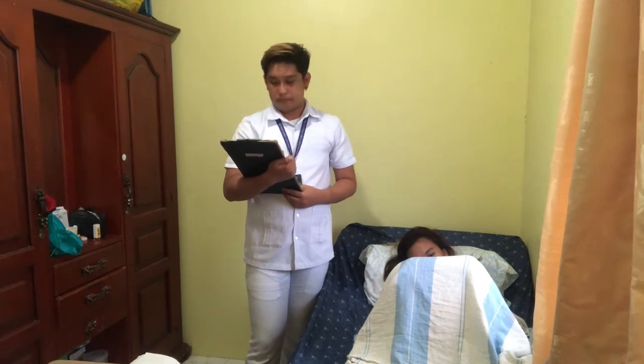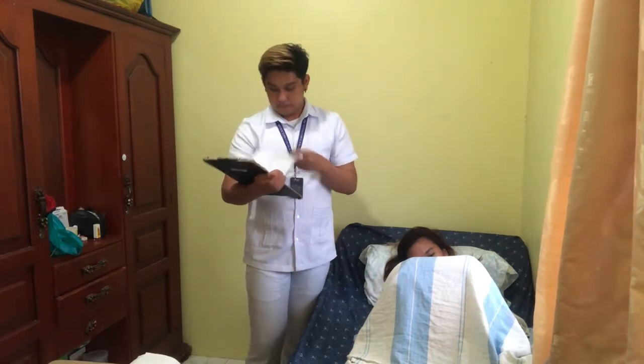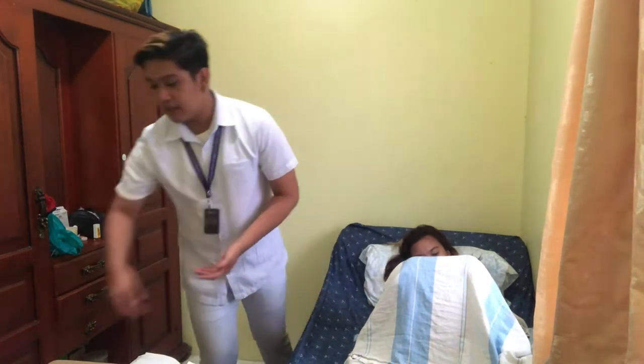This is for us to make sure that we have the right patient and the right procedure to perform. And after that, we'll perform hand washing to avoid cross-contamination which may cause infection to our patient. So we'll also perform hand hygiene by using alcohol.